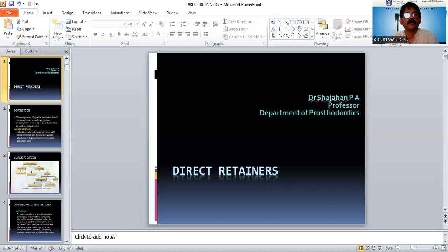So retentive terminal is the distal third of the retentive arm. It is the only component that is placed below the height of contour. The retentive terminal is the portion of the clasp which is placed in the undercut to get the retention, and body connects the rest and shoulder to the minor connector, and shoulder connects the body to the clasp terminal.